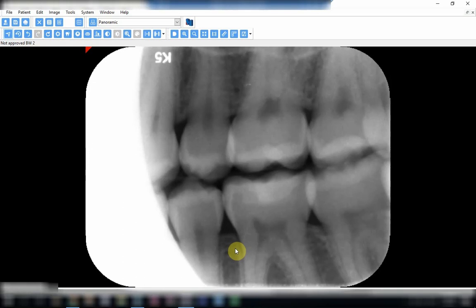Welcome again everybody to a new session in which we will talk about some errors seen when using the angle bisecting technique. In this bitewing radiograph you can see that this radiograph actually has two mistakes. The first one is the clear cone cutting over here — this part is not exposed.